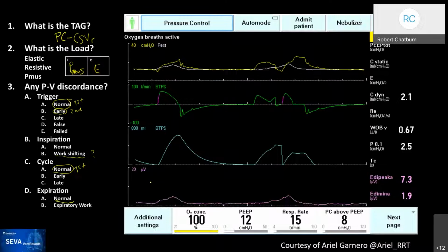Recently, they have upgraded it so that it no longer defaults into pressure support. The reason I was told was that too often patients would get locked into pressure support and couldn't get back into NAVA, and people thought they were on NAVA and they weren't. So I have no idea what level of software this is, but I think it's a pretty good read. Everything that was said looks pretty good.